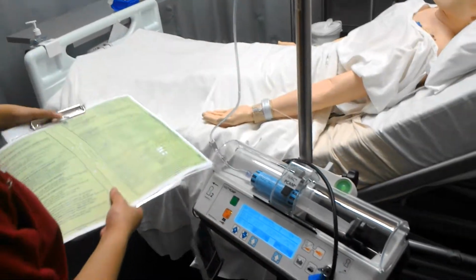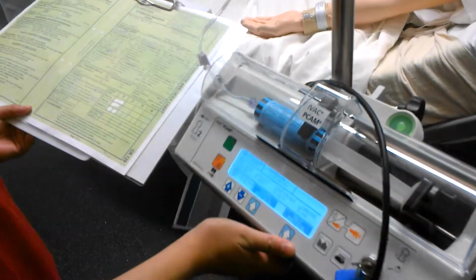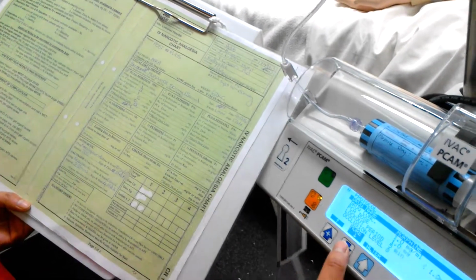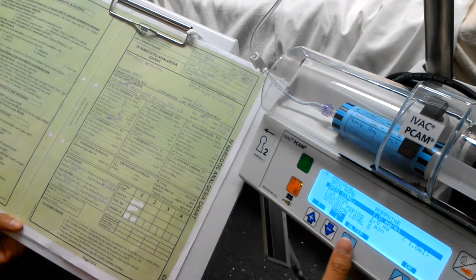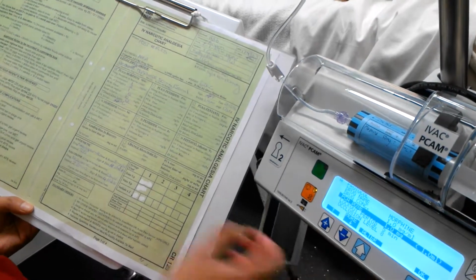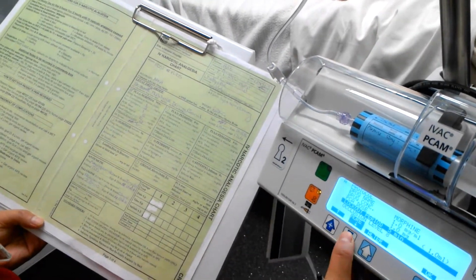So for my notes, I can see here that this is already set for morphine, so I'll keep it as is. Drug is morphine, and from here I know that's morphine needed here. Drug concentration is 1, so I've got 1 milligram per 1 mil, so I'll keep it as is. PCA dose is 1, so I'll keep it as is as well. Lockout period, we've got 5 minutes here and we've got 5 minutes here, which is correct.